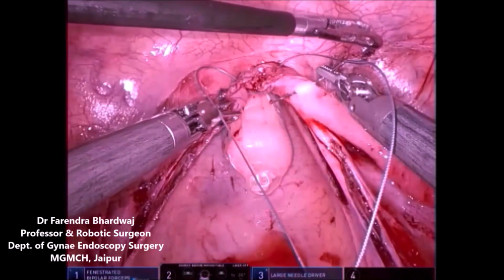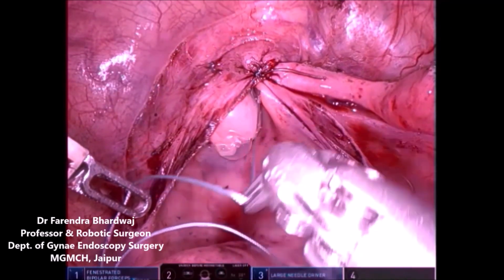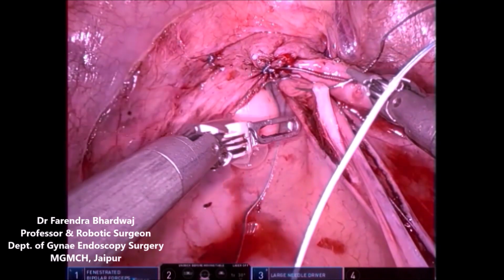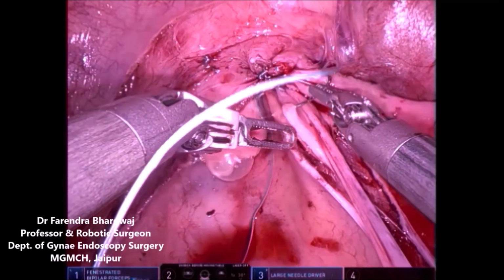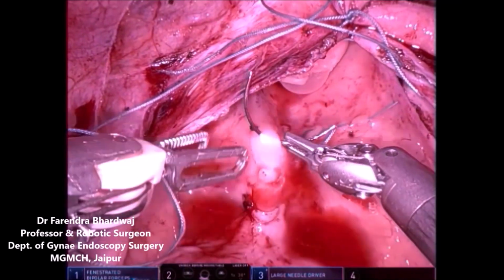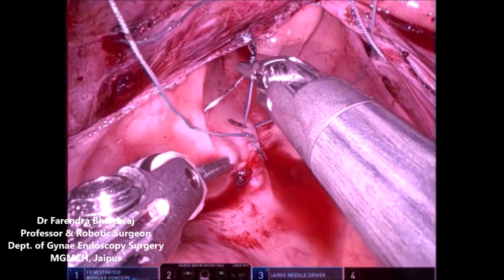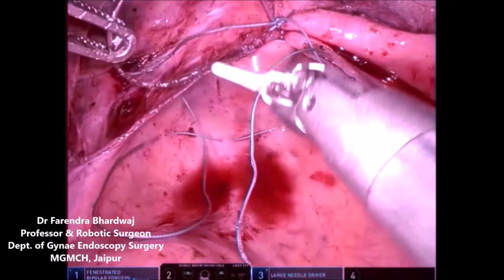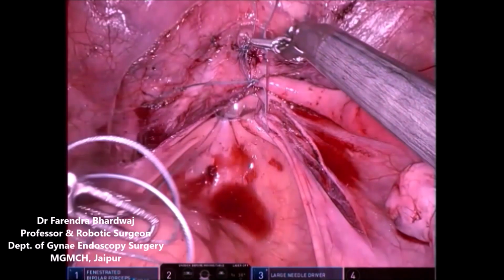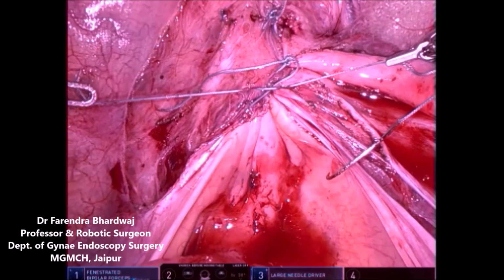Now a vaginal mold is placed into the cavity through the vaginal opening, over which the neovagina is created using peritoneum and posterior rectal peritoneum all around. A bite is taken through the anterior wall of the rectum as well, and a purse string suture is placed to form the apex of this newly formed vagina.